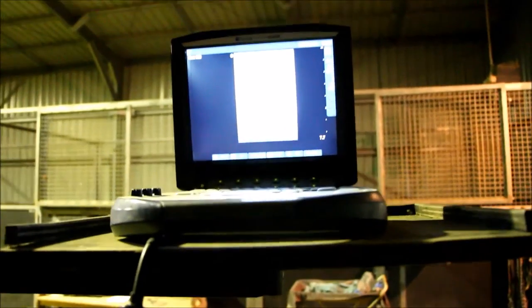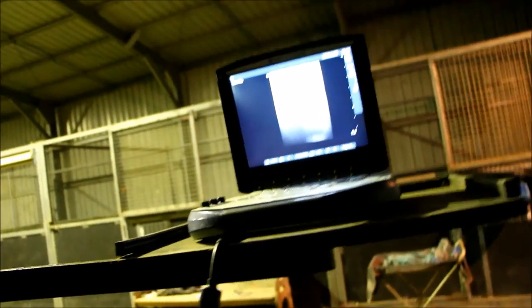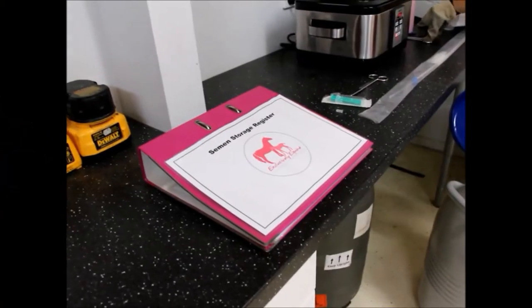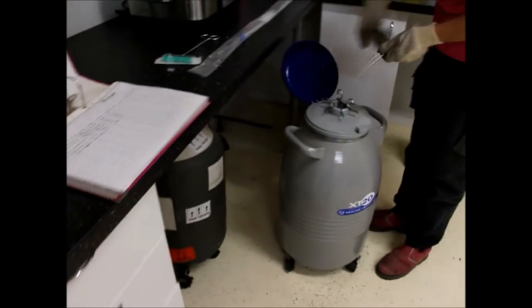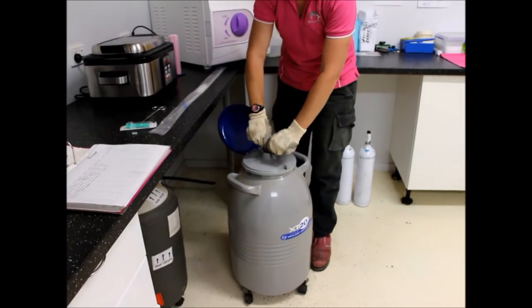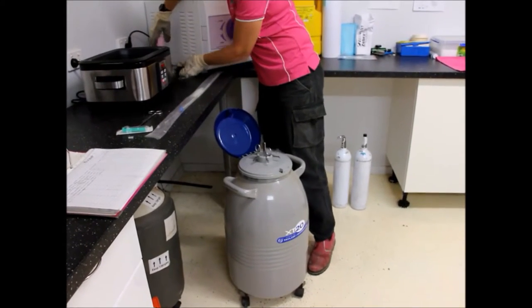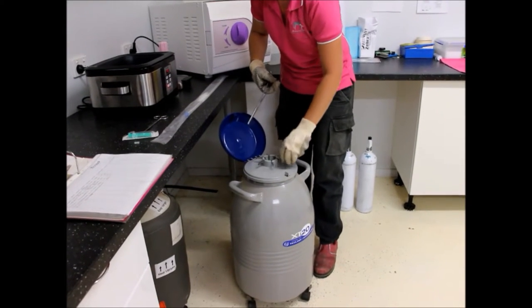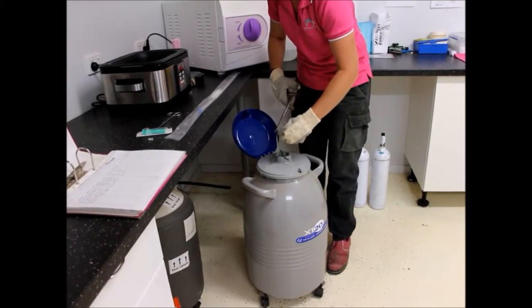We then go through the process of preparing the semen. Frozen semen is stored in liquid nitrogen canisters. At Exclusively Equine we have a very good record keeping book, so we go to our book to see where the semen is stored and in which bucket. We look at the goblet colour and straw colour, which is recorded when the semen arrives. We normally identify the semen before we even open the canister, then remove the semen very quickly into a constant water bath at about 38 to 39 degrees.